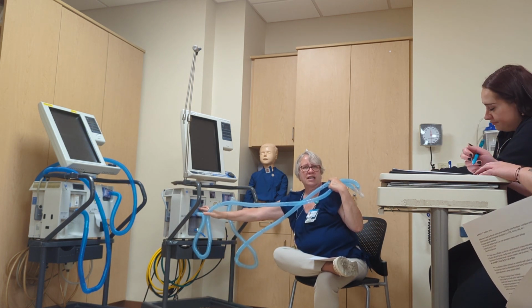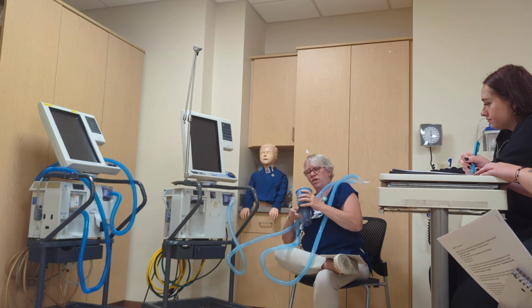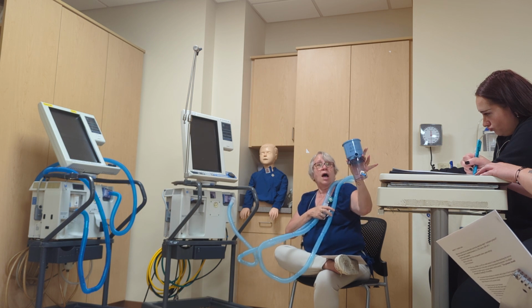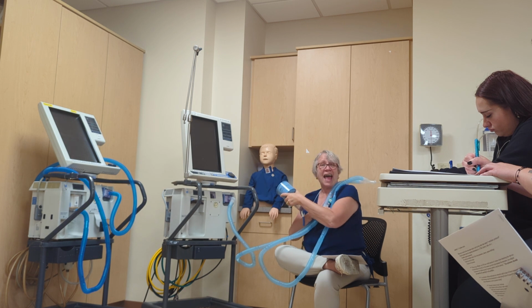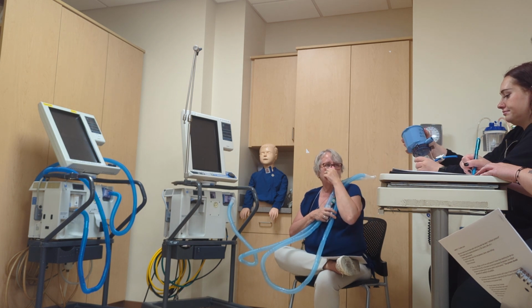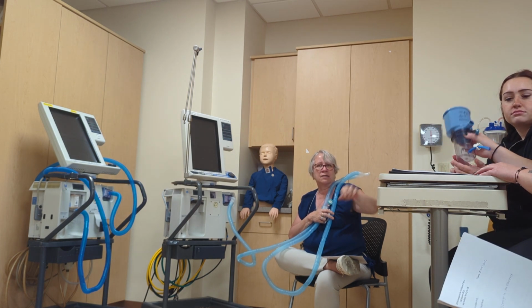The purpose of the expiratory filter, it's here. The expiratory filter is actually the blue portion. It looks like this for PB840s. It can look exactly like an inspiratory filter on different models, okay? But this one has an expiratory filter, and underneath of the expiratory filter is called a dump, okay?